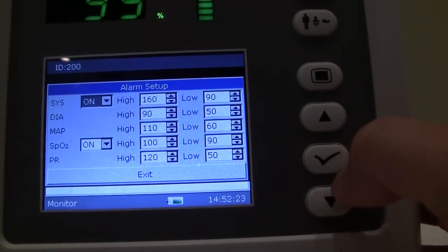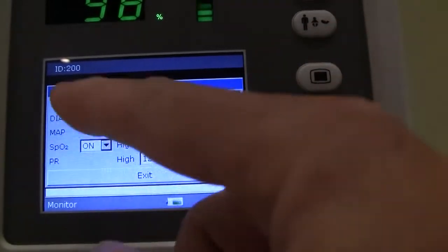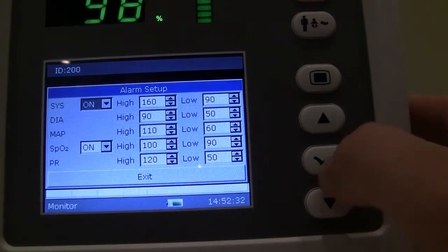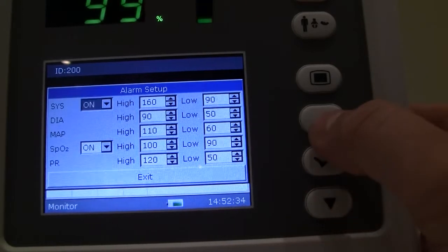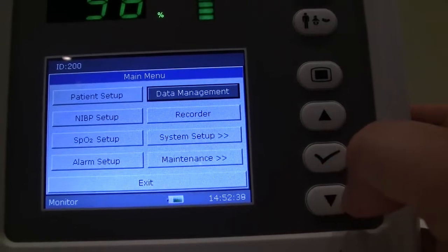Alarm setup, this is where you want to set all your high and low alarms. You can see you can set up your systolic, high-low, your diastolic, high-low, mean arterial pressure, etc. Configure that however you want, and if your patient's vitals change above and below those parameters that you dictate, it will sound the alarm.